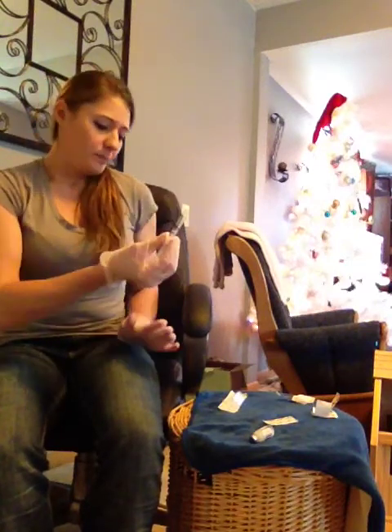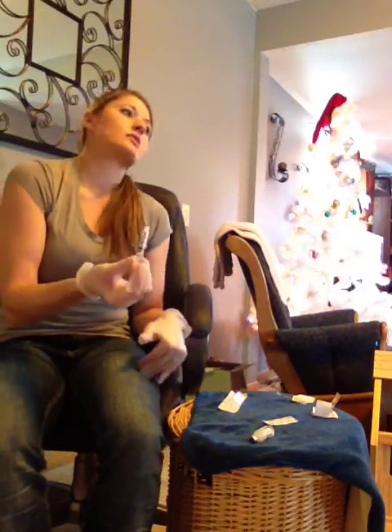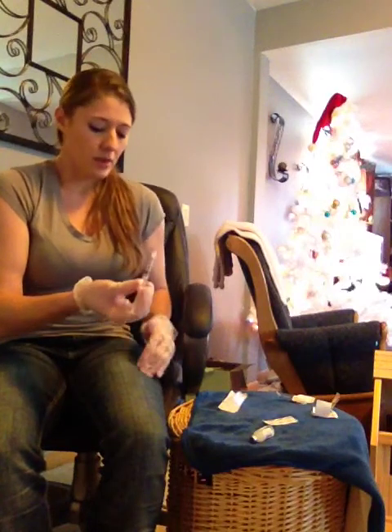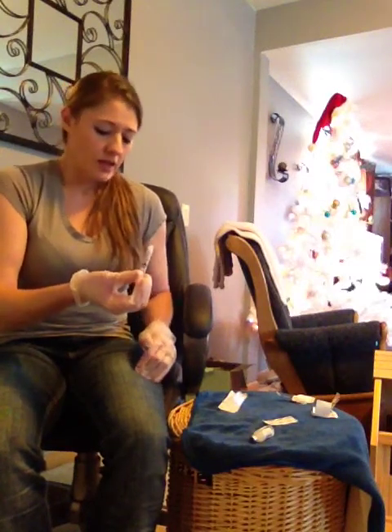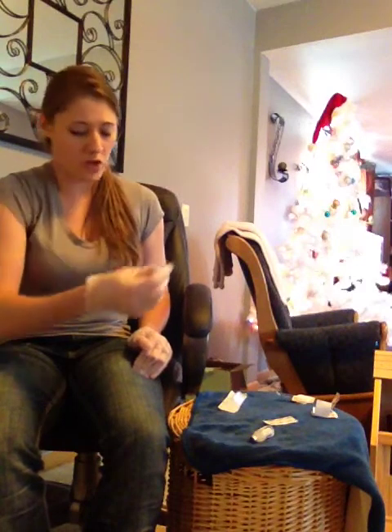And the Z-track method is used because we want to be able to keep all that solution that we inject into that muscle in the muscle. Sometimes when we're using a larger gauge needle, like a 21 gauge needle, you're going to have solution that comes back out through your injection site. So for the Z-track method, I'm going to pull the skin backwards and sideways, creating kind of like a Z shape.